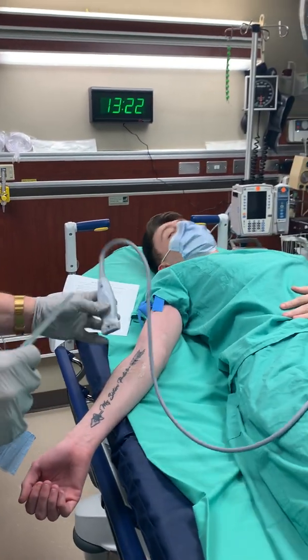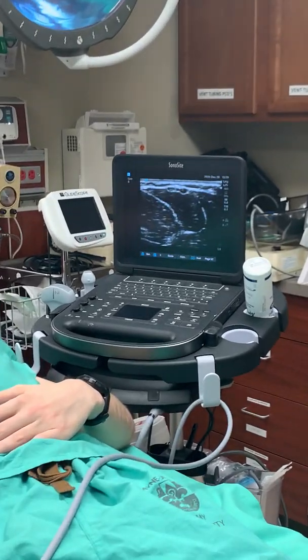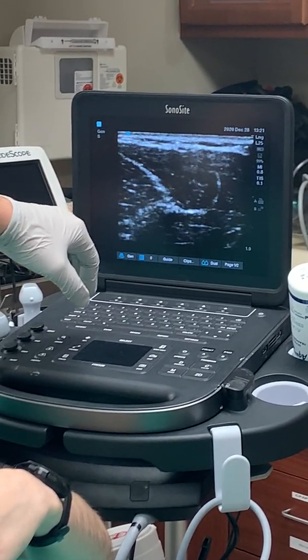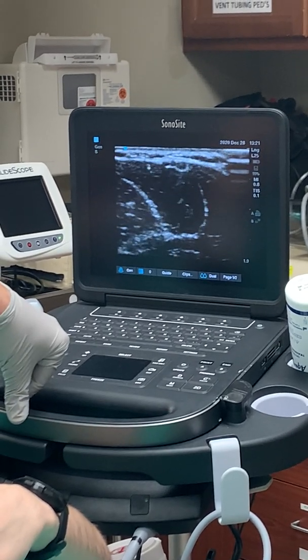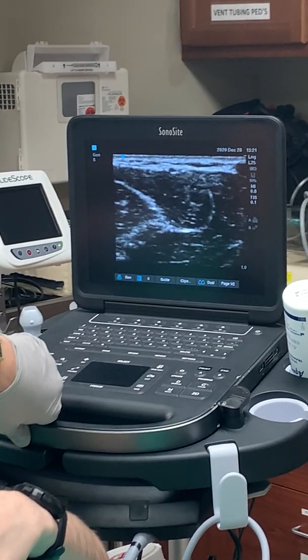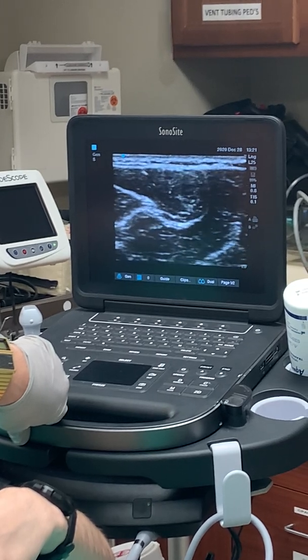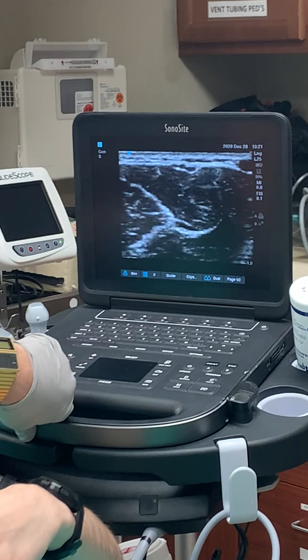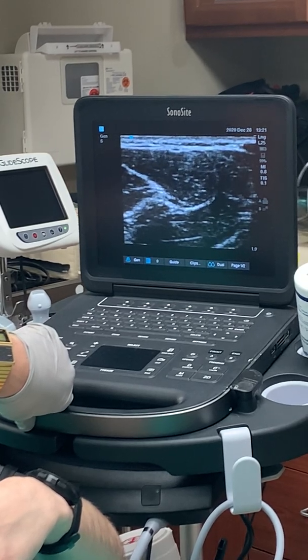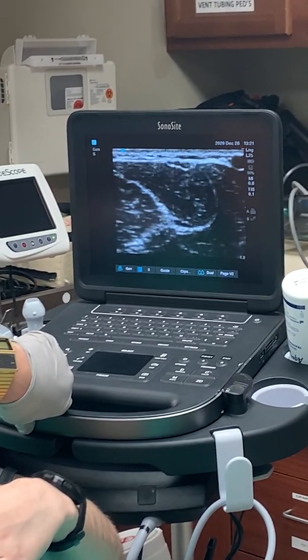Before I put the IV in, I'm going to verify that I'm putting it in a vein, not an artery. You can see there are three vessels right here. If I press down, there's one in the middle that's winking — see that pulsation? That's an artery, so I would not put an IV there. What I want to do is press down on my veins and make sure they close off. If it doesn't close off and it's making that pulsating motion, don't put an IV in it. Sometimes in the forearm if you press too hard you can close off an artery and think it's a vein. So I don't completely collapse the vessels — I go about 80% collapsed — and then I can still see that winking vessel, meaning that's the artery, and next to it on the left and right are two veins.